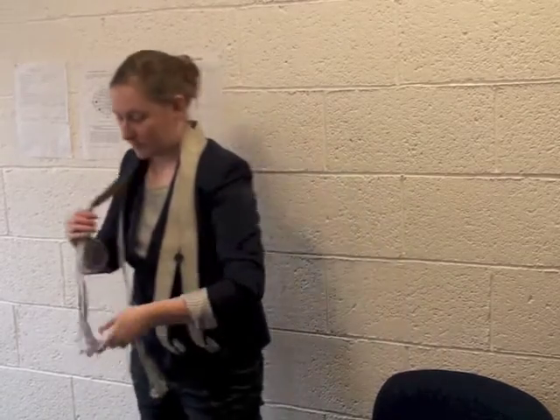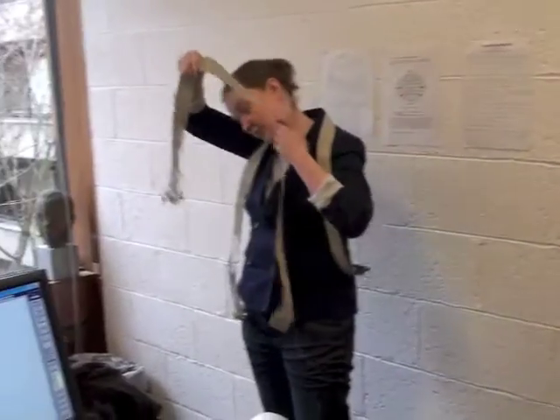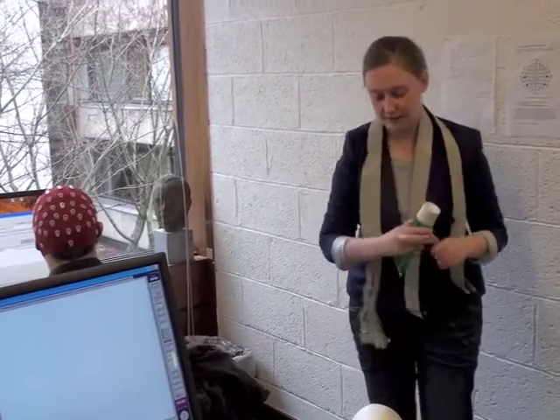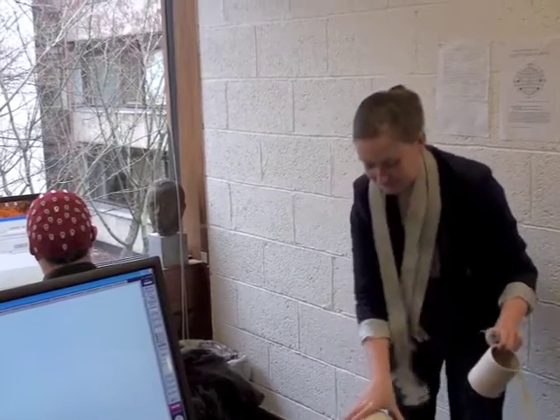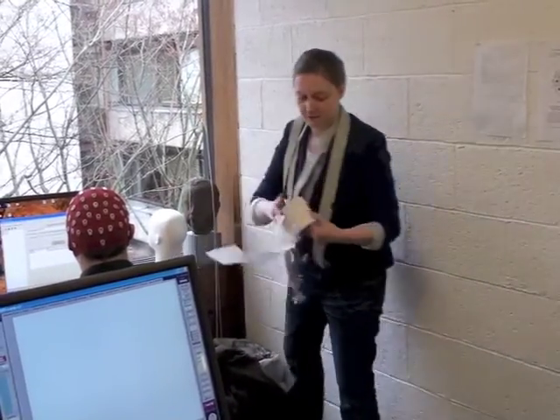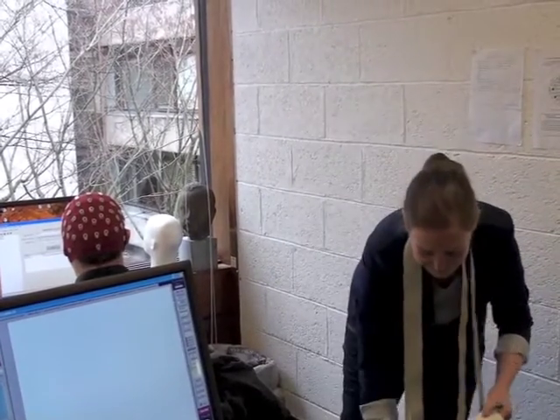Okay, so I'm going to do the entire left side of Bren's head first, working from back to front. This can be a bit messy. Friend over here. Okay, so I have plenty of tissue paper ready.